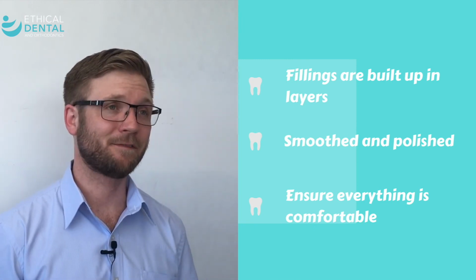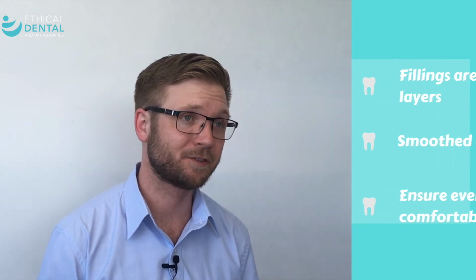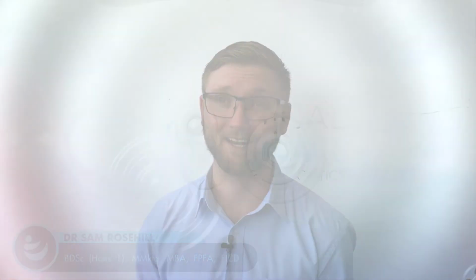And finally, once we've filled the cavity or we've built up enough structure, we'll smooth and polish the filling so that it feels comfortable in your bite and feels smooth on your tongue. Most tooth-coloured fillings are strong enough to eat on the day that they're placed, but it's still a good idea to be careful for the first 24 hours, especially if you've had to have a local anesthetic.